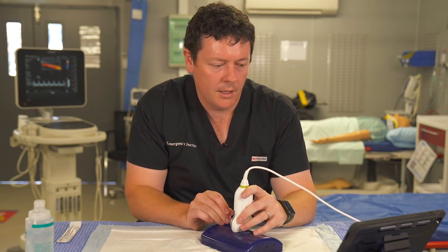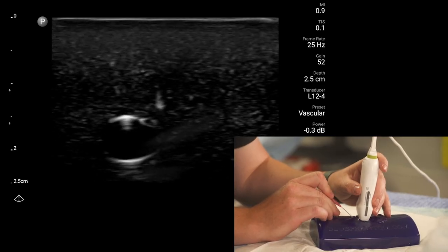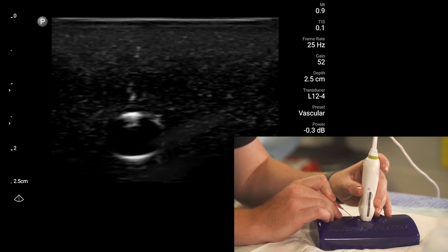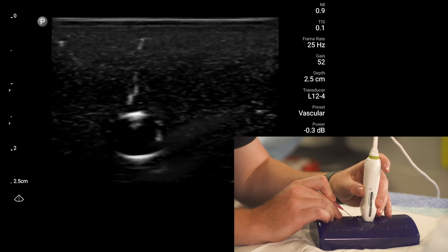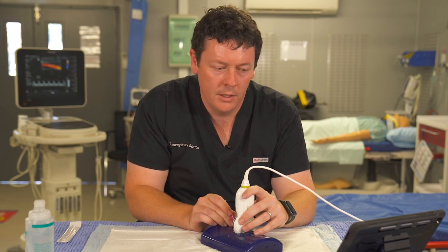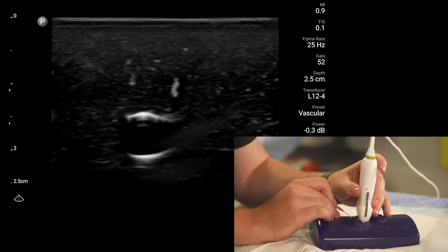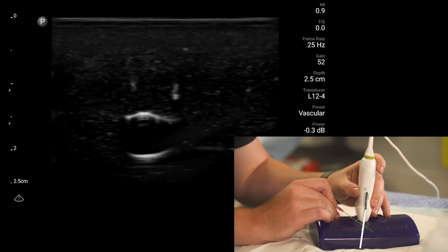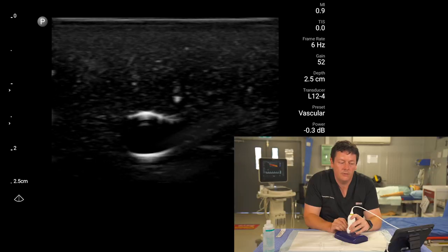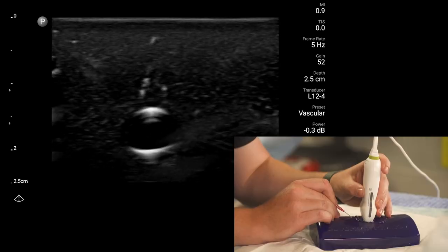The key points: quick through the skin, find your needle tip, then — probe forward, needle forward — follow the tip the whole way to your target. An important warning: the ultrasound beam cuts through the middle of the needle and can look like the tip. If you're seeing that, you might think you're not in the vessel yet when actually the needle is already much deeper. Always make sure you are tracking the true needle tip.